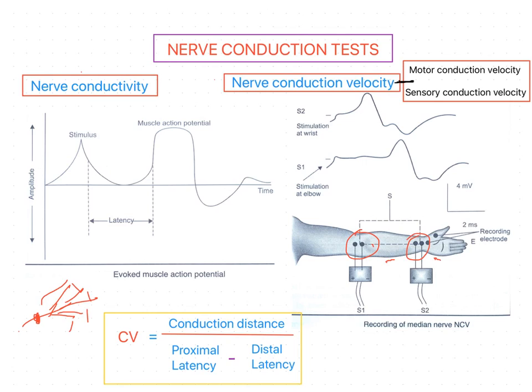At the distal site, single pulses are applied to initiate impulses in many axons to activate the motor end plates of many thousands of muscle fibers, causing a brisk muscle contraction. This can be displayed with the stimulus to show the conduction time between the stimulus and the start of the muscle contraction, called latency.